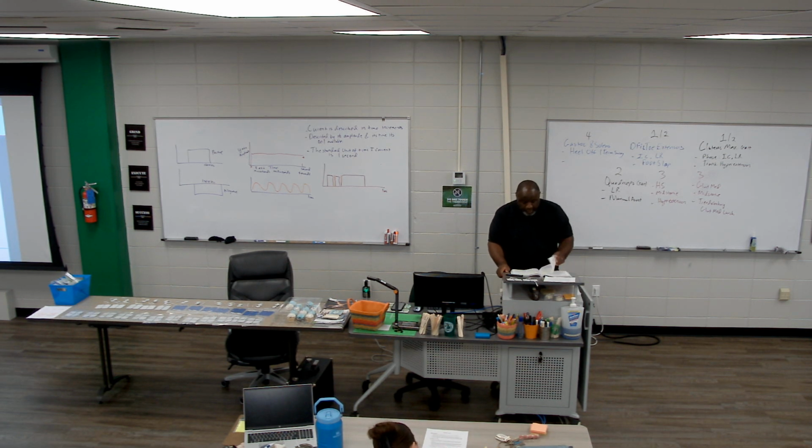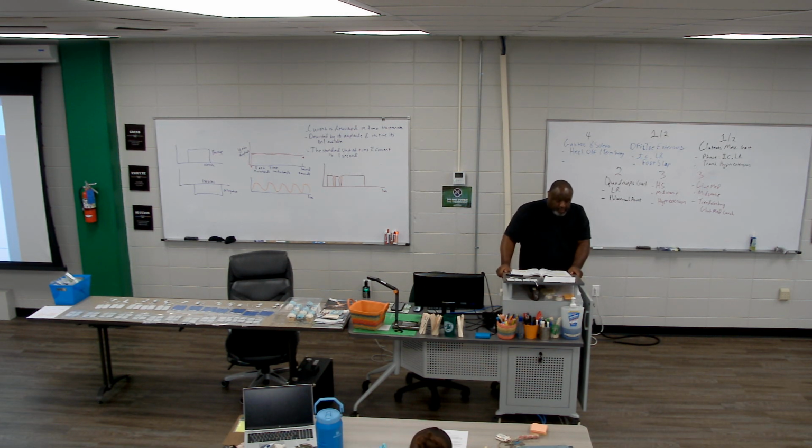Okay, next page. It says E-stim produces 3 excitatory responses. So turning our amplitude up will give us 3 different responses primarily. One will give us a sensory response. It'll be tingling, vibrating, kind of a superficial feel.